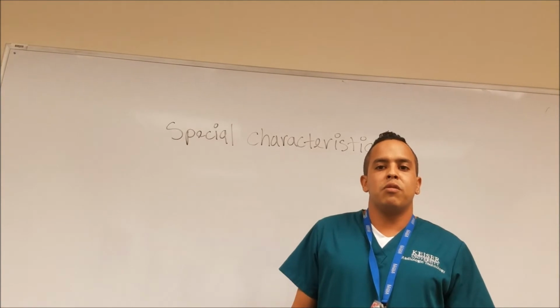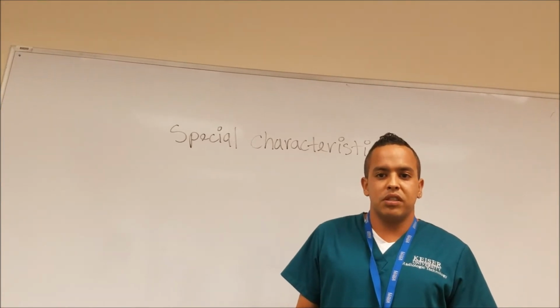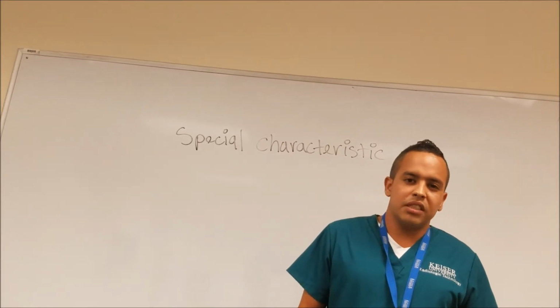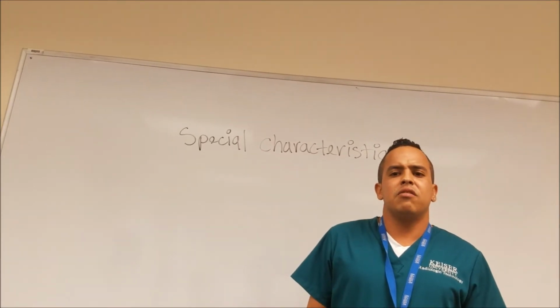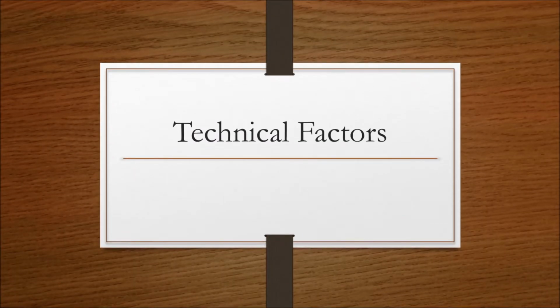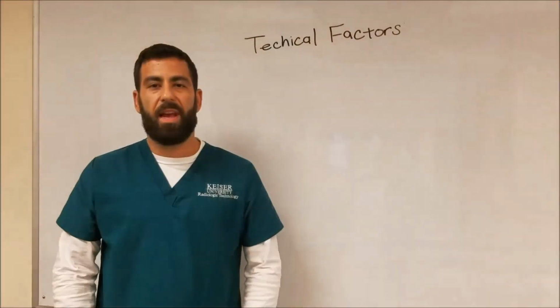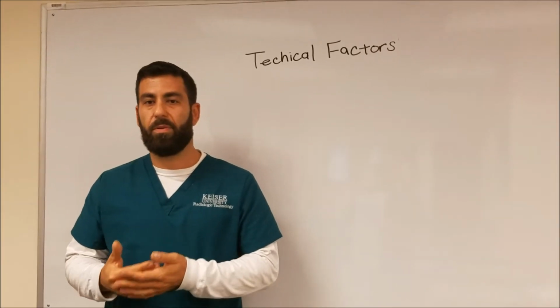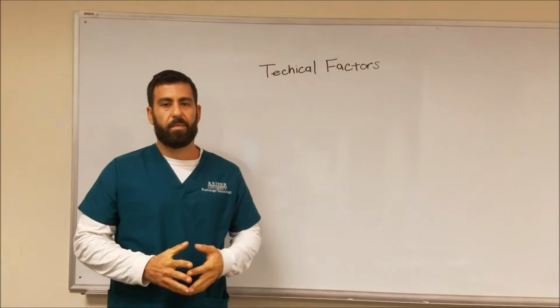Furthermore, fluoroscopes operate by foot pedal with a dead man switch. It is like the kill switch of a jet ski, shutting off the fluoroscope instantly. This is an extra level of safety against unnecessary radiation exposure. Most fluoroscopes have an adjustment process called auto fluoro, which is programmed for the procedure.